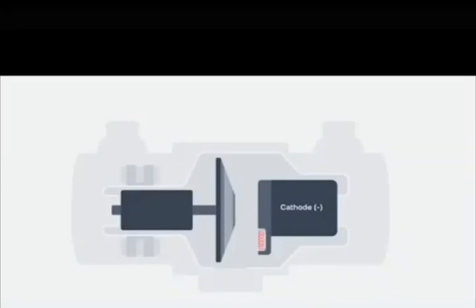All X-ray tubes have a cathode. The cathode creates free electrons through the process of thermionic emission. You should also know that the cathode is negatively charged. This makes sense because the cathode is the source of these negatively charged electrons.